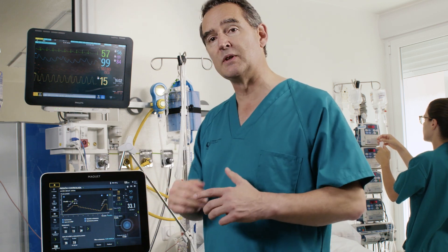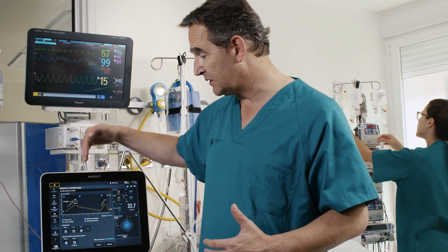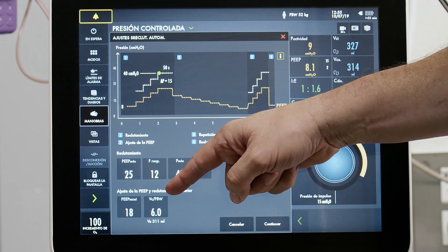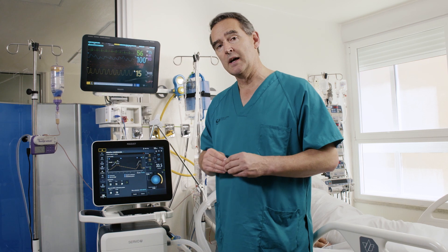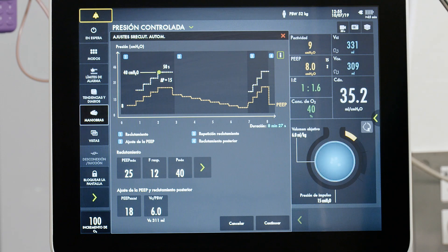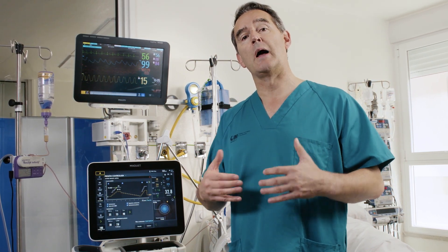During the decremental PEEP trial, the ventilator switches from pressure control to volume control mode, and PEEP is decreased stepwise in 2 cmH2O steps. Dynamic compliance is measured breath by breath, and we follow compliance behavior to find its maximum during these decremental PEEP steps. Maximum compliance marks the point at which the most dependent lung starts to collapse — this corresponds to the closing pressure.